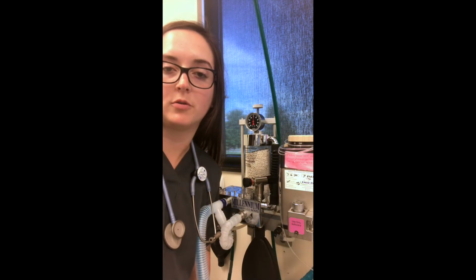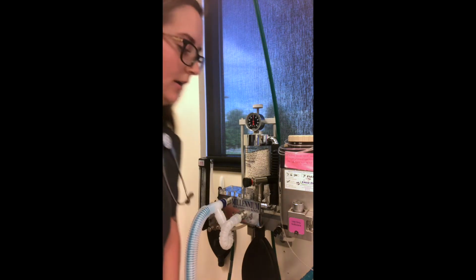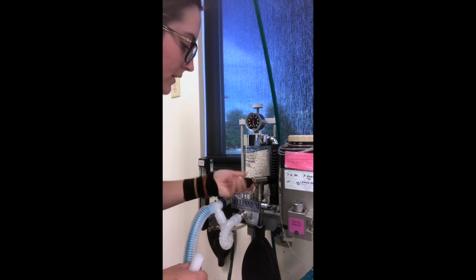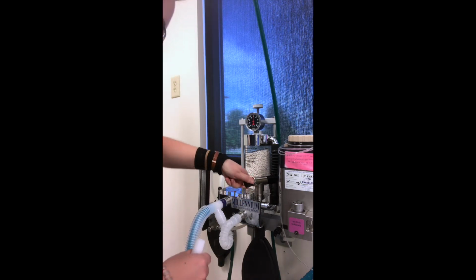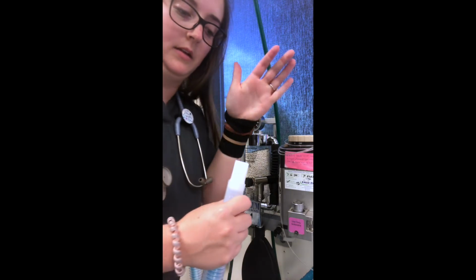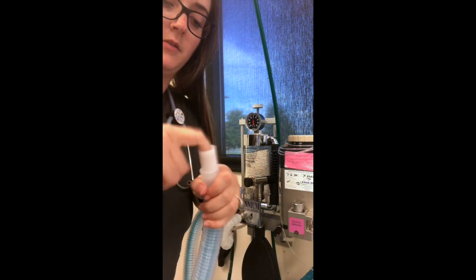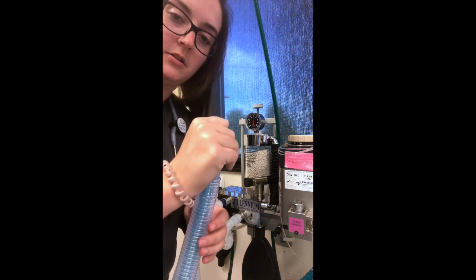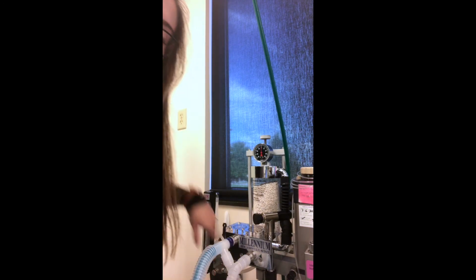So I'm going to perform a leak test on one of our anesthesia machines here. The first thing you want to do is close your pop-off valve. We have that closed. We're going to go ahead and occlude the top of the tubing either with a finger or your palm. Make sure there's a good seal there. Use the flush valve to fill your reservoir bag. I'll show that.